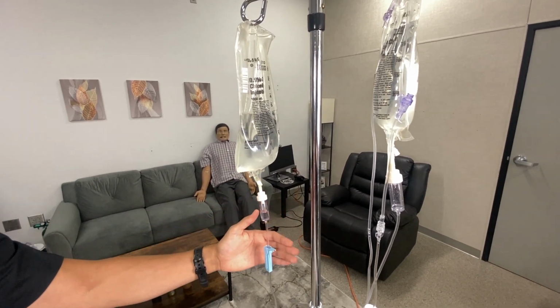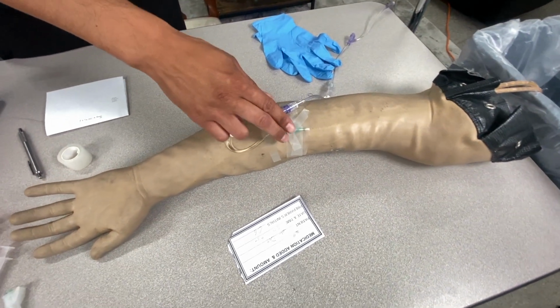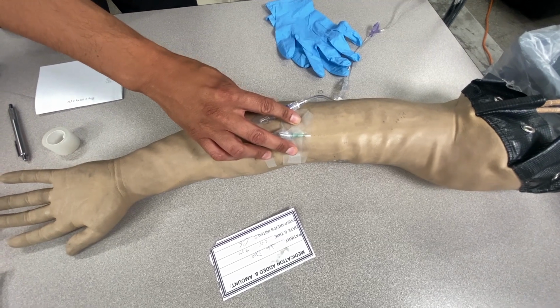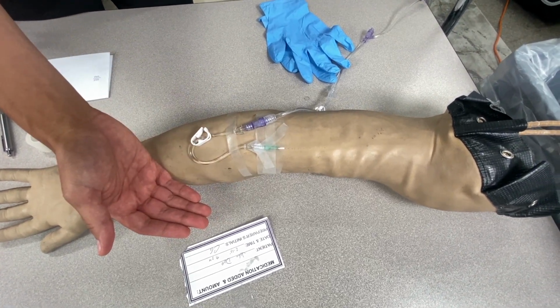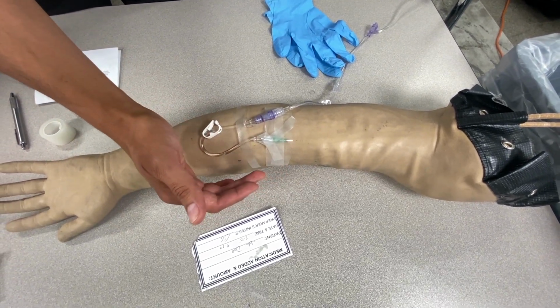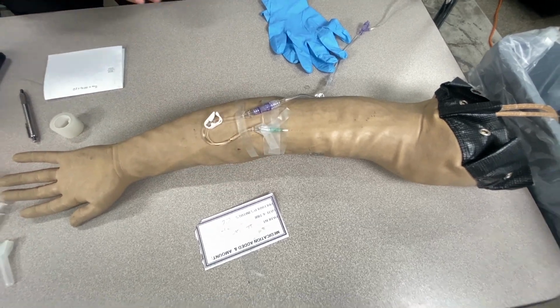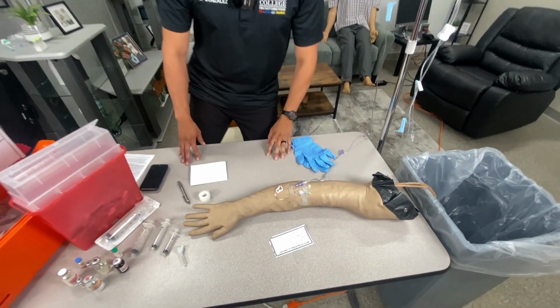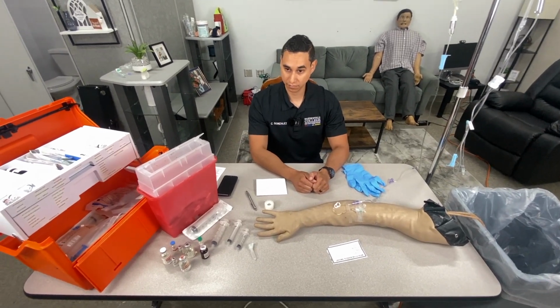And I want to make sure that my IV that is connected to the patient is good and not infiltrated. I will open it up, let some fluid run. There's no infiltration. All right, so we are good there. So I am now ready to start the scenario.